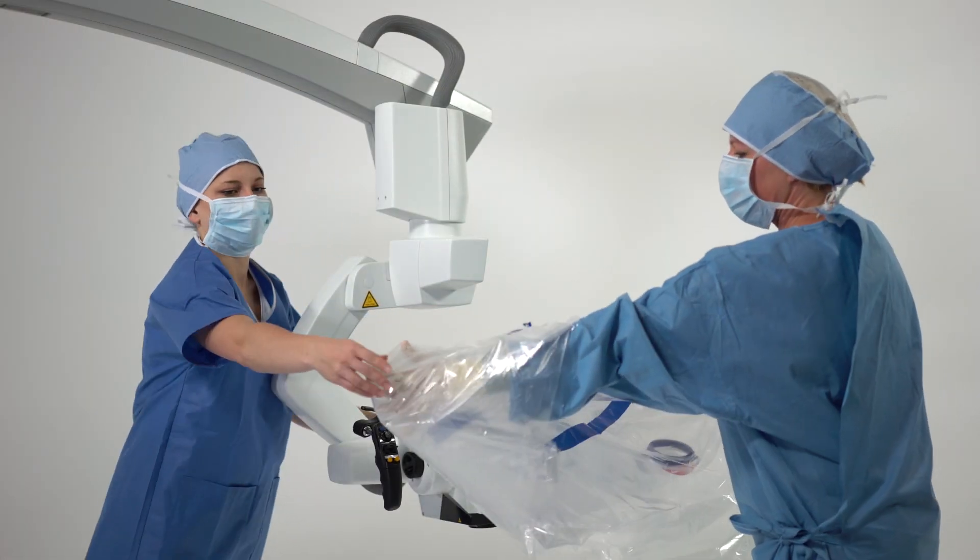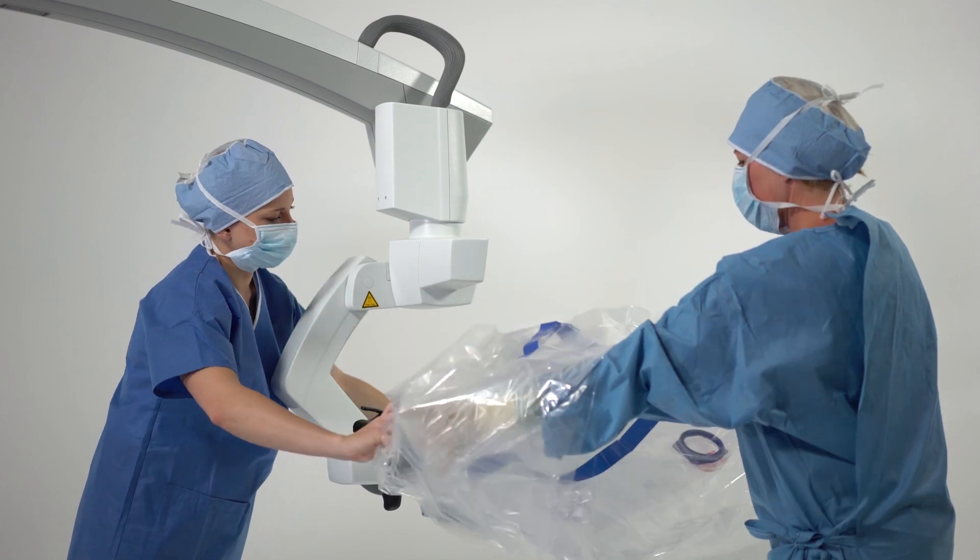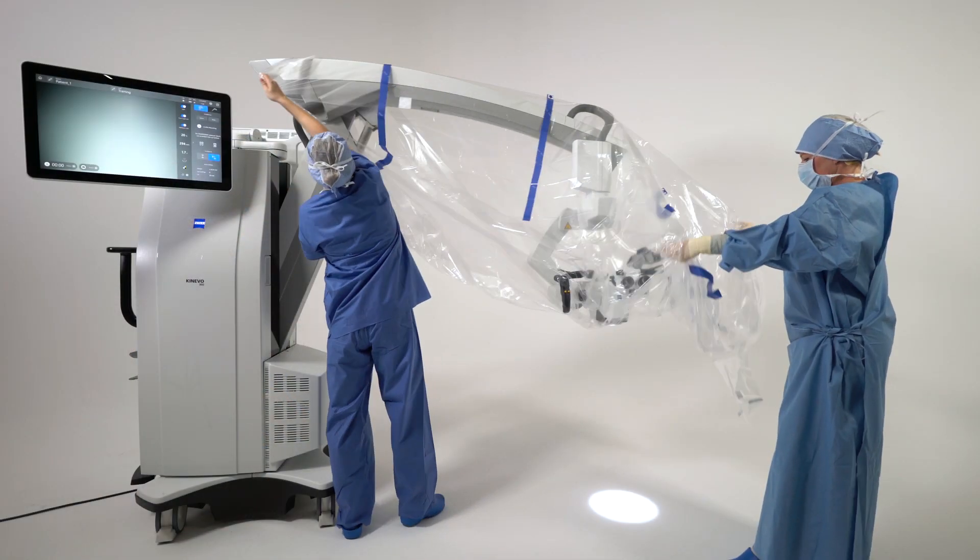First, cover the head of the Zeiss Kenevo 900. Then slide Zeiss Smart Drape over the arm.